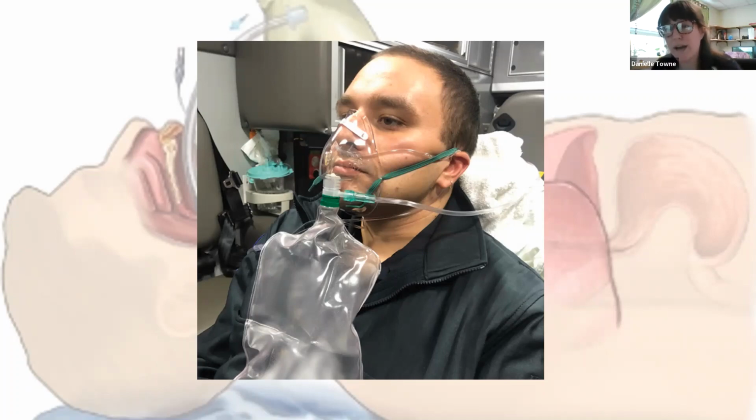So we're not going to do this and then wait half an hour, and then do the intubation. We're going to get this set up and do the nasal cannula. We're going to put the mask on for 3 to 5 minutes and set up the rest of our equipment for the intubation. Then, when we're fully ready, as we're going to talk about in some later steps, we will come back, remove this non-rebreather, and begin the intubation attempt while you can still keep that nasal cannula on. And it just works really nicely.